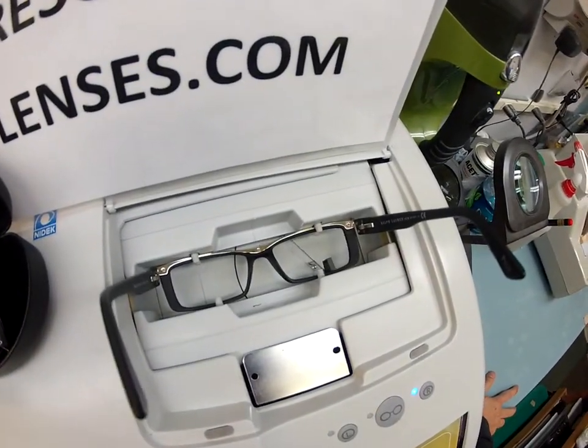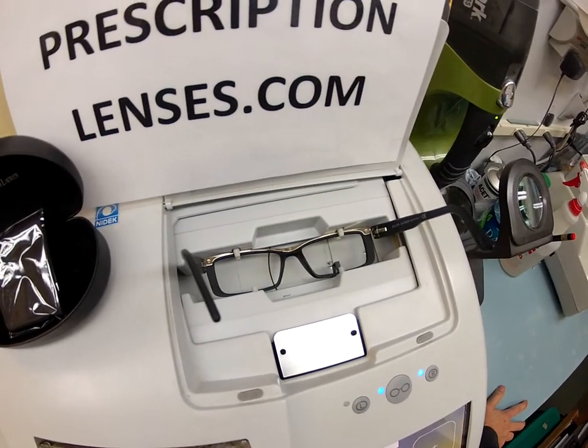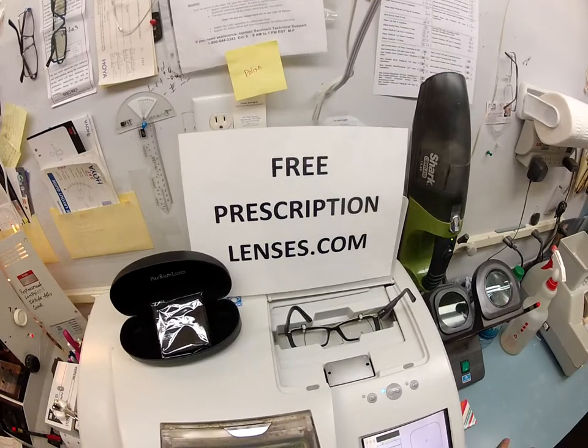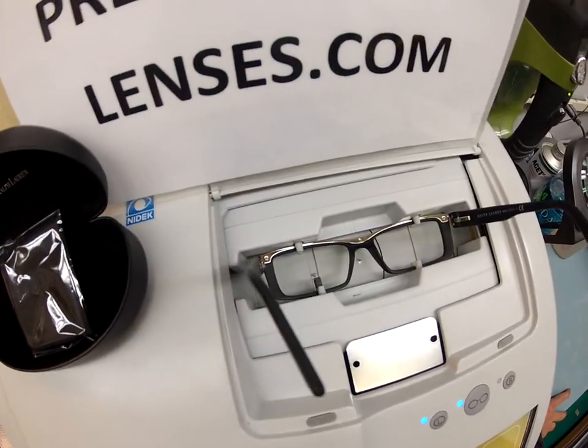It's going to trace the shape of your right lens and then it's going to come over and trace the shape of your left lens. Here at FreePrescriptionLenses.com, where everyone loves a bargain and no one is disappointed with quality.